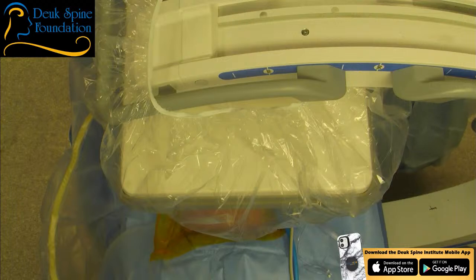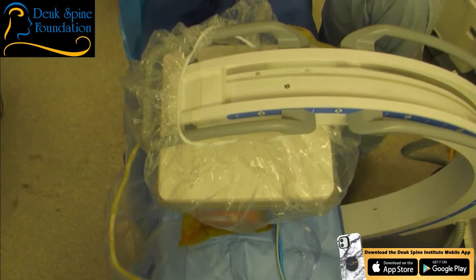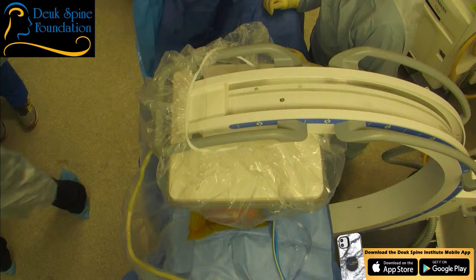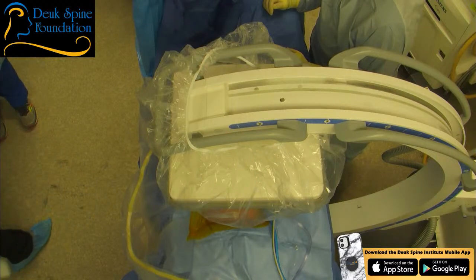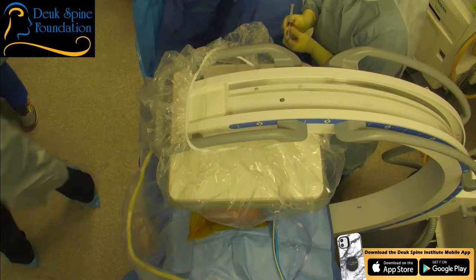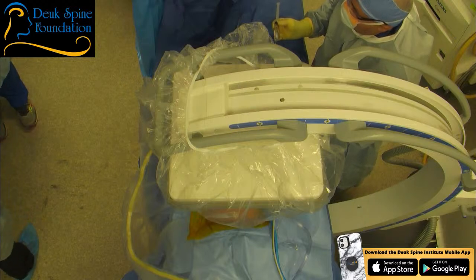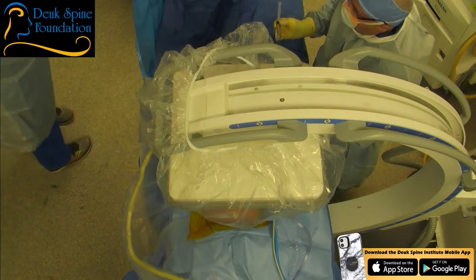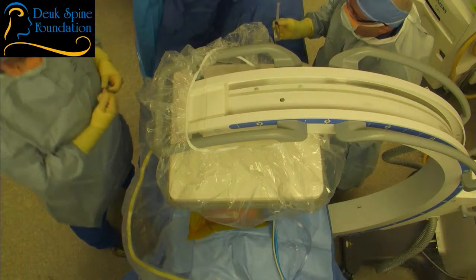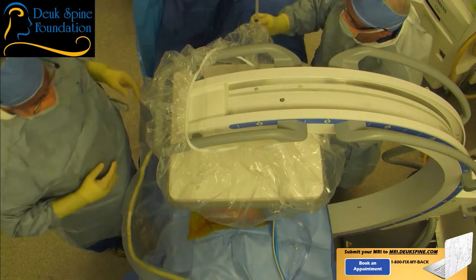It's Dr. Deukmedjian. It's 12 o'clock, and we're getting ready to start a Deuk laser disc repair, L4-5, L5-S1. That's a patient who has two herniated discs, L4-5, L5-S1. She's having back and leg pain on the right side, which is what most people with herniated discs, when they have symptoms, are going to have: back pain and leg symptoms. And whether they have symptoms in the leg on the right side, left side, or both sides depends on whether the right side, left side, or both sides of the disc herniation are symptomatic. There's really very little control the patient has over that.